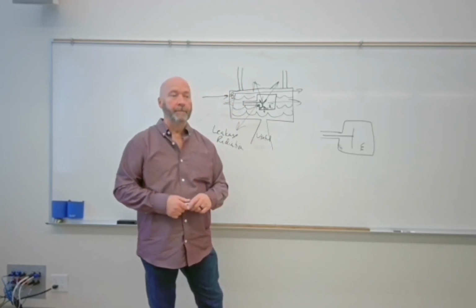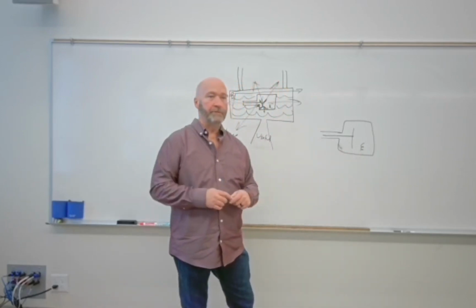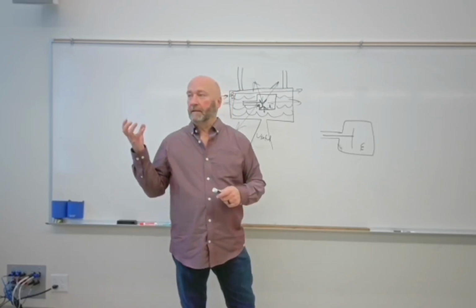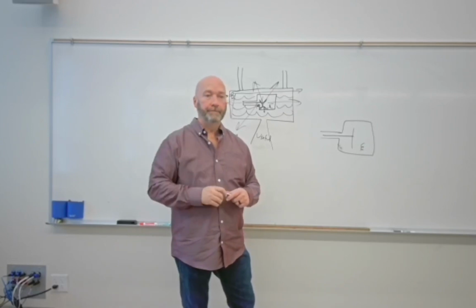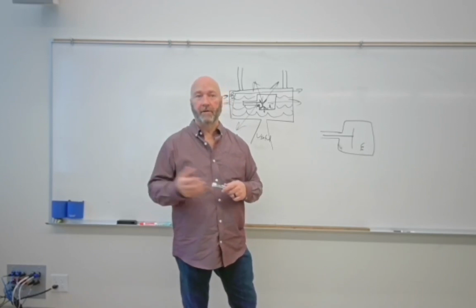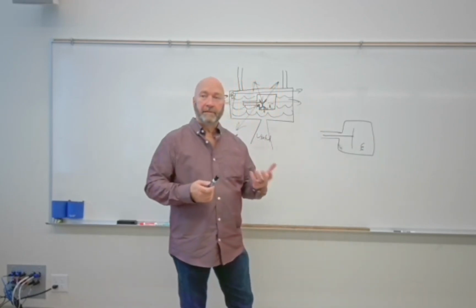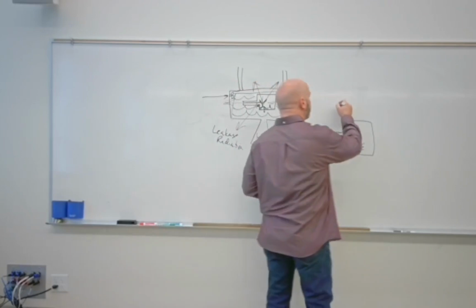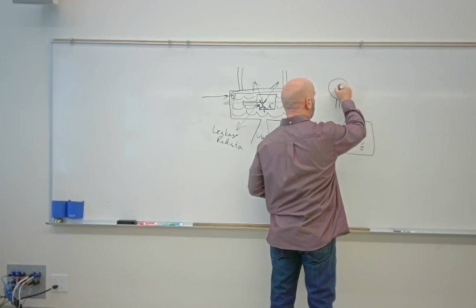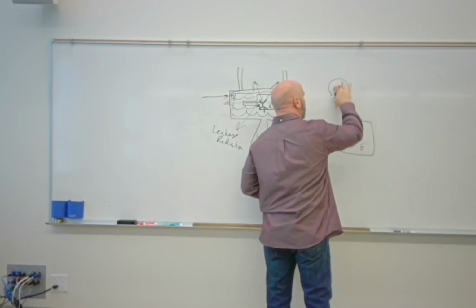It's just like a light bulb. In a light bulb, the filament's made of tungsten as well, and your light bulbs don't last forever, right? Incandescent light bulbs are the ones that get hot. You turn them on and then you can't reach up and touch them, right? They're getting to be more and more rare, but they still are out there. They eventually burn out. What happens is that you've got what we would refer to as an open filament, which just means it's burned out.